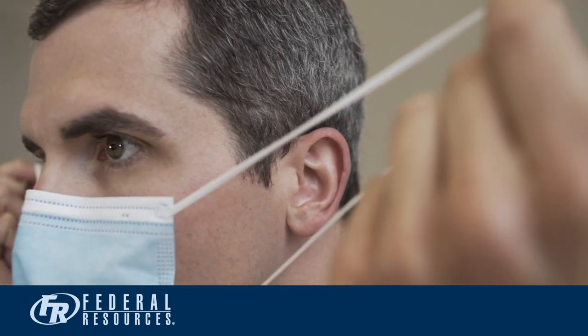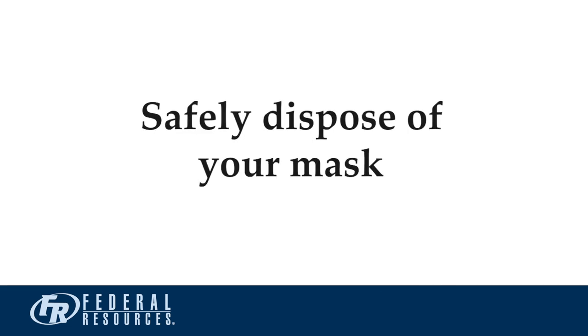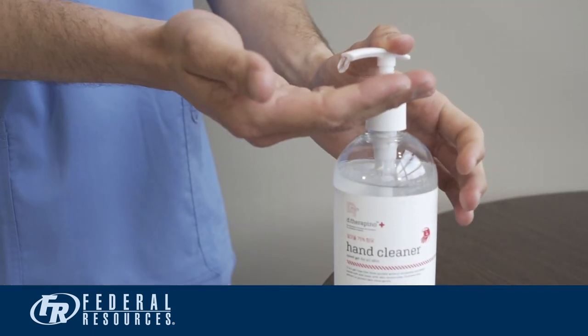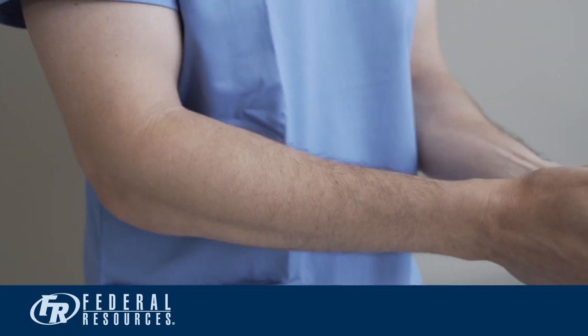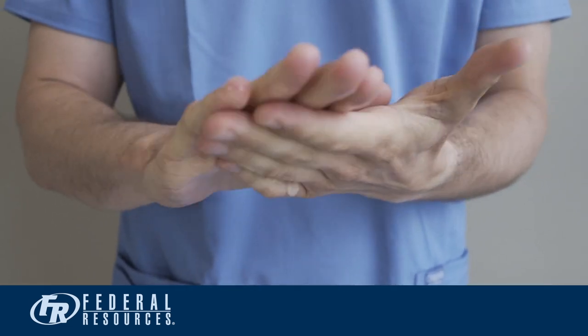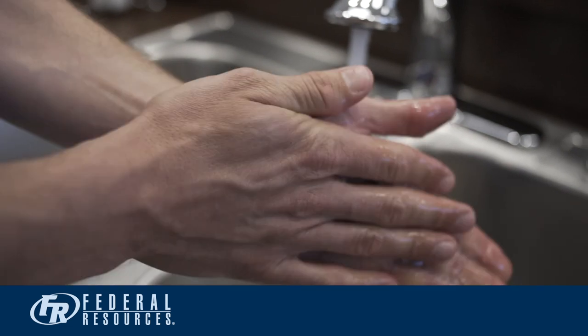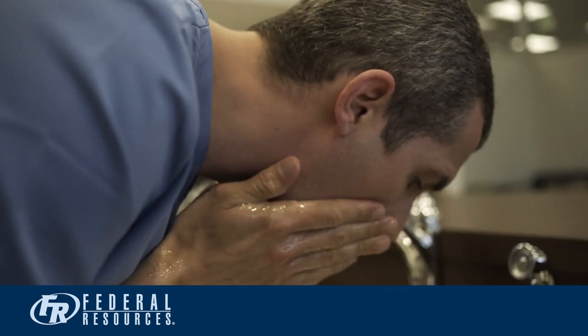Now, take your mask off. Bend slightly forward, grab the ear straps from around your ears and pull forward. Safely dispose of your mask. Once PPE is removed, wrap up the doffing procedure by once again using an alcohol-based hand sanitizer for a full 20 seconds. Finally, wash your hands and exposed skin around your face and neck with soap and warm water. Now, you are ready to move on to caring for the rest of your patients.